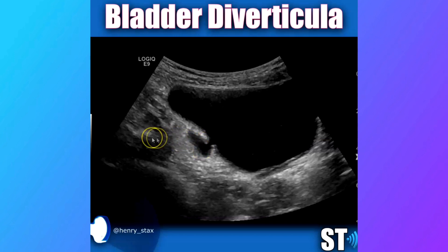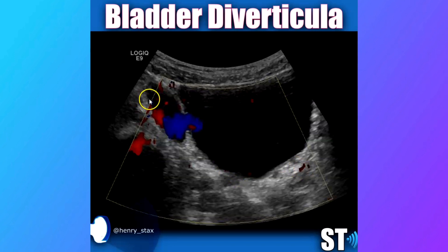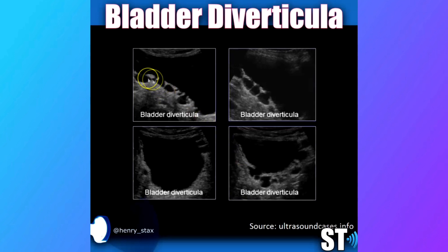You can also see fluid entering and exiting with color Doppler, just as you would use it to see jets going into the bladder — you can see the urine going into and out of the pouch, oftentimes in a to-and-fro pattern. And it can be singular or many, as you see here with many little diverticula.